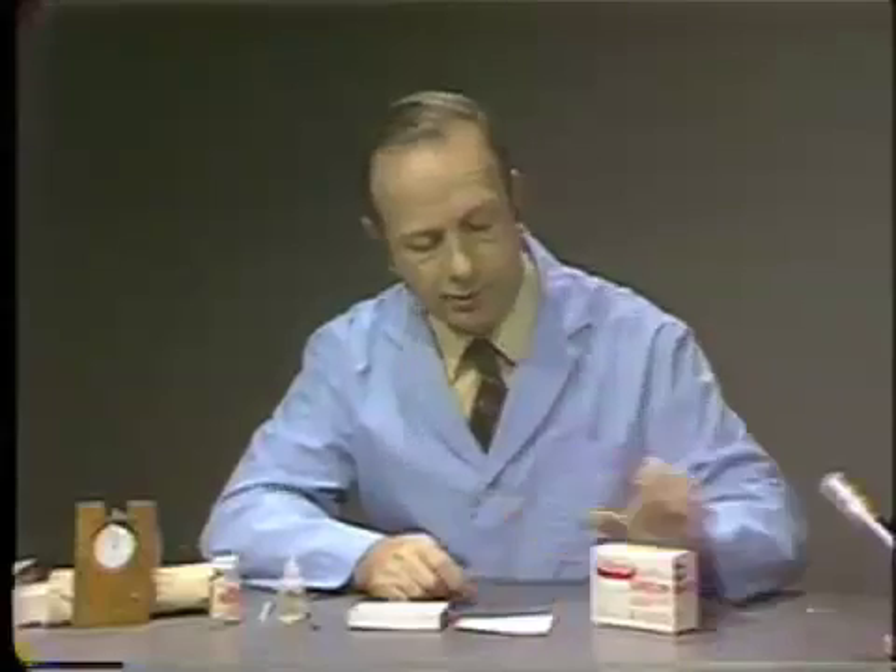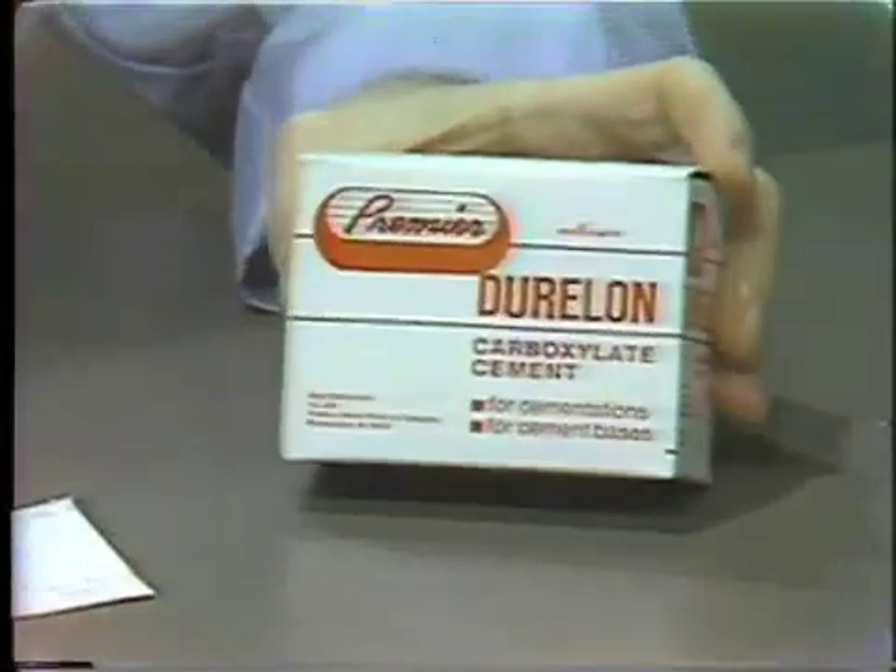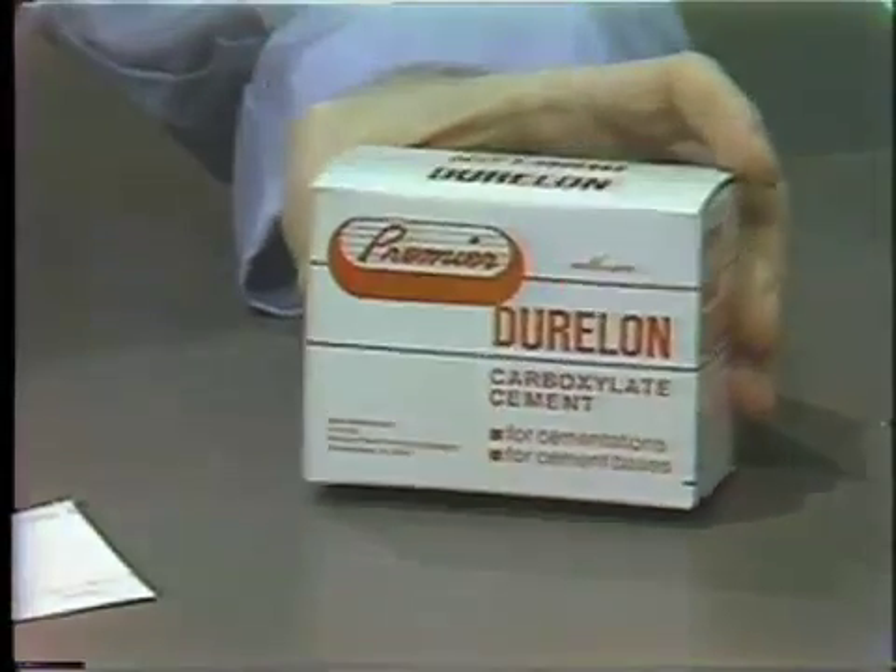The first material introduced into the market is a product called Duralon, and this is the product which you will be using in the laboratory.